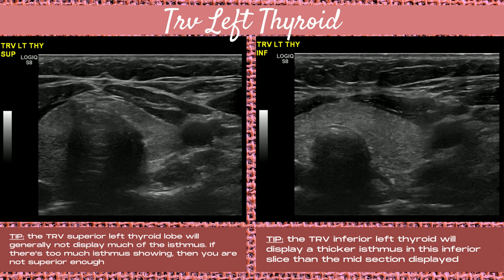Next, image the transverse left thyroid superior and inferior poles. Generally when imaging the superior poles, you're not going to visualize much isthmus — if you see a lot of isthmus, you haven't angled up superiorly enough. However, some people have a very small superior section; in those cases, use discretion. Try to get high enough where you're not showing much isthmus, but gauge it based on how large the superior portion of the thyroid lobe is.